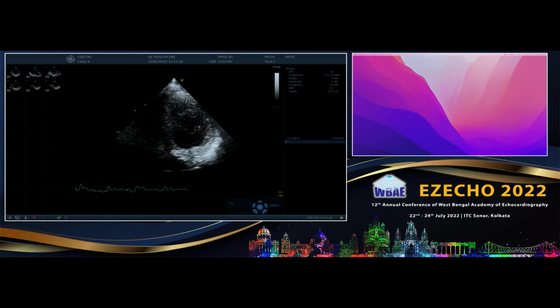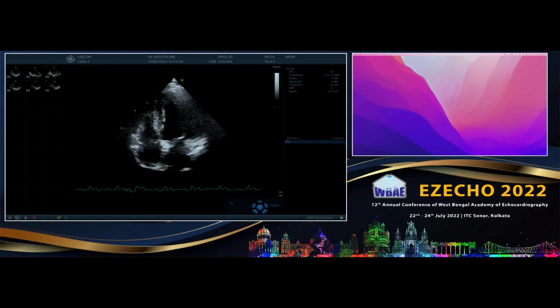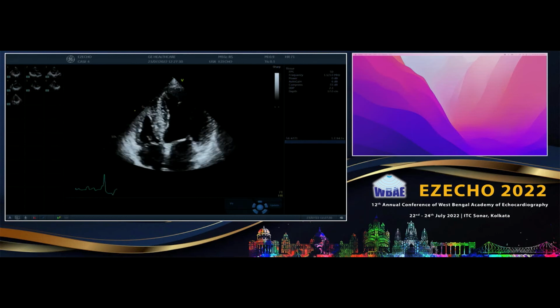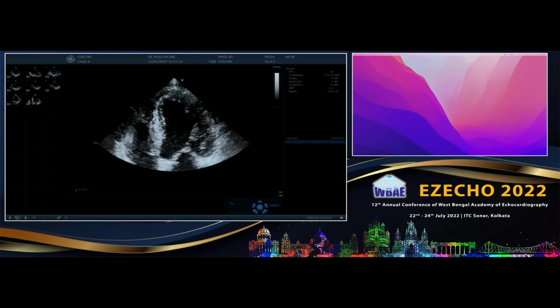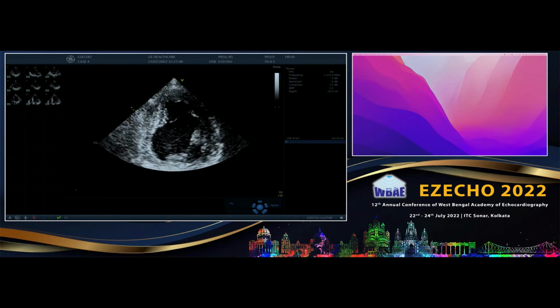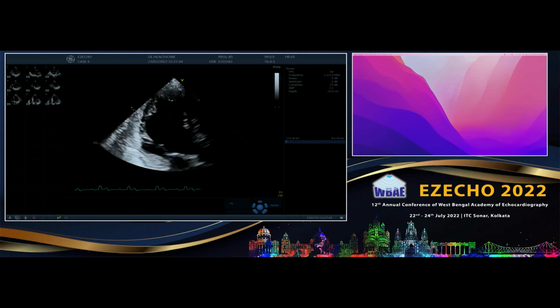Let us go for a 4-chamber view, which is the first long axis view. Good 4-chamber. I just want the LV now. We are not interested in the LA. So reduce the depth, take only the LV in the center, and you should see the endocardium perfectly well. Store it. Take a 2-chamber view, store that. Take a long axis view and store that.